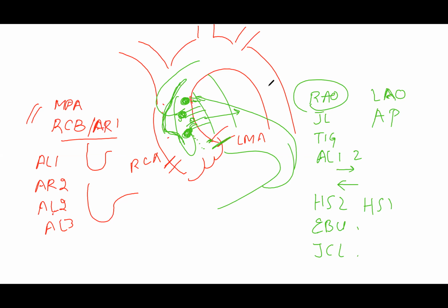All right, so that was pretty much it about the graft anatomy and how I access them and use catheters. All right, any questions that you guys have? Dr. Qureshi, do you have cases of these grafts? We can look them up in a second.